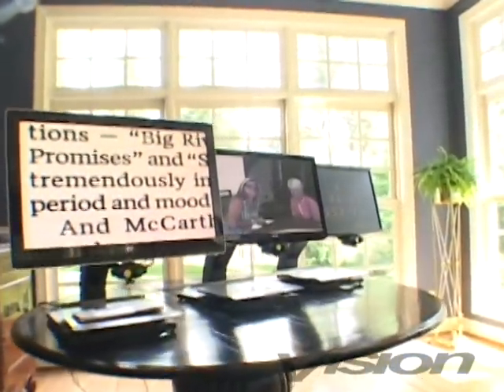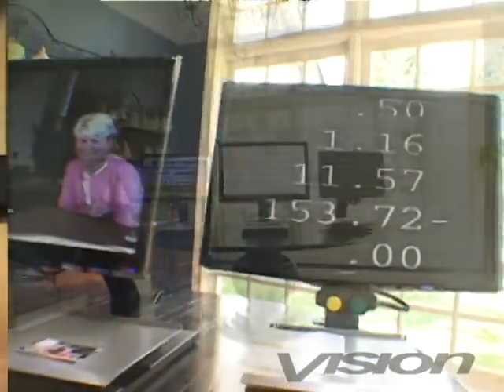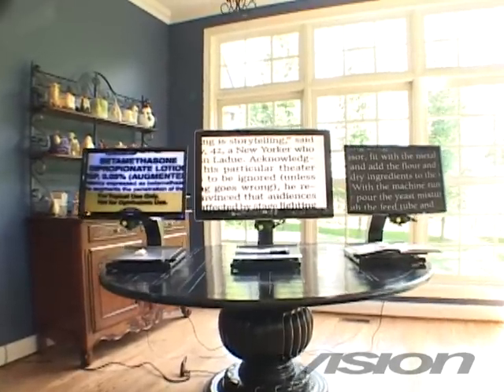Freedom Machine offers the largest monitor selection in the industry. The standard display is a high resolution 22 inch monitor. 24, 26 or 28 inch high brightness displays are also available to provide improved viewing without glare.